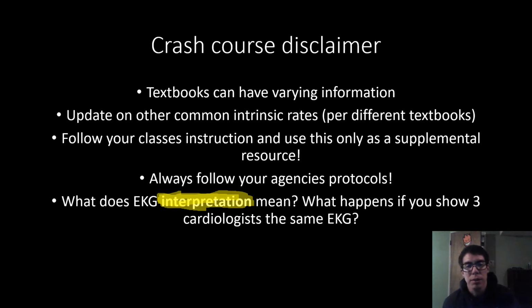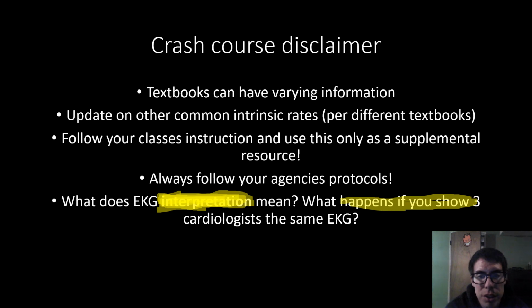So just remember what EKG interpretation means, and be aware of the fact that there are those differences, and sometimes it's more opinion based. And remember what will happen if you show 3 cardiologists the same EKG, because that will help you to remember that there are variations, and in the end it is only EKG interpretation.